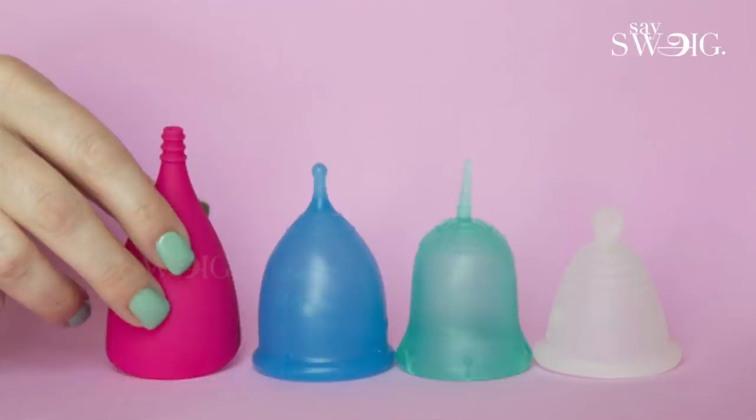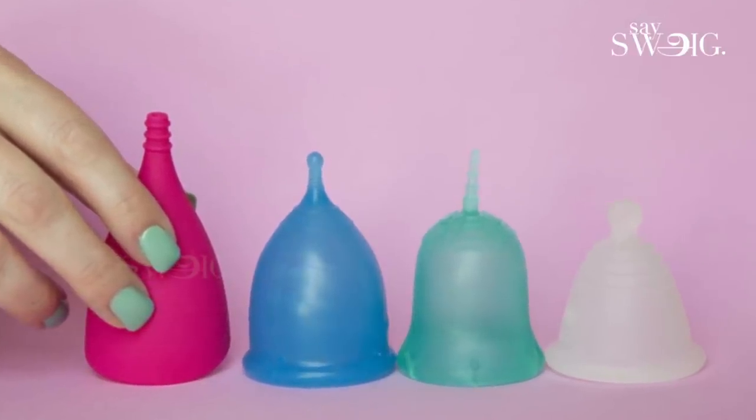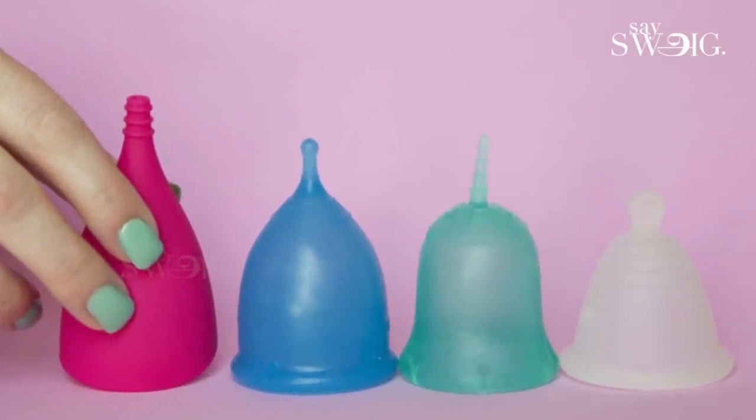One more thing — sizes. In menstrual cups there are different sizes. It's a trial and error method. You buy one and try it. The basic thumb rule: virgin or small — start with the smallest size. Then medium and large. Your vagina is also a dynamic, elastic muscular organ, not a rigid tube, so practical comfort will guide you to choose the size.